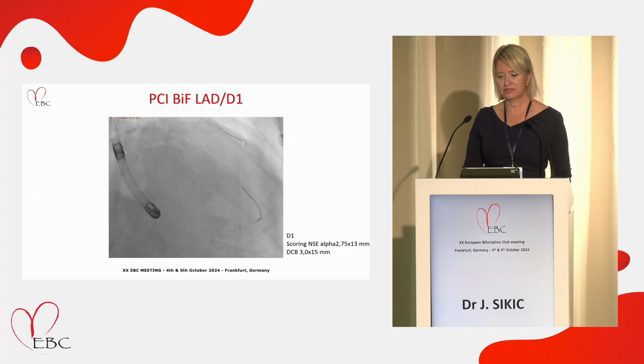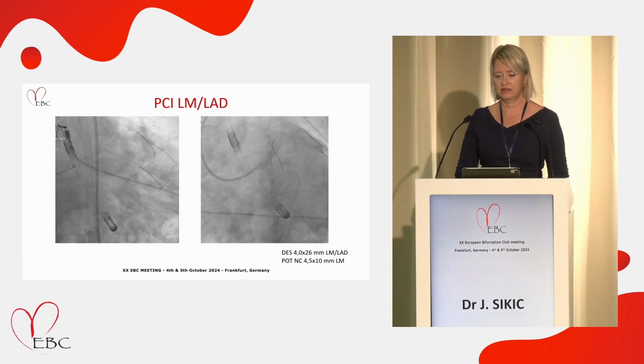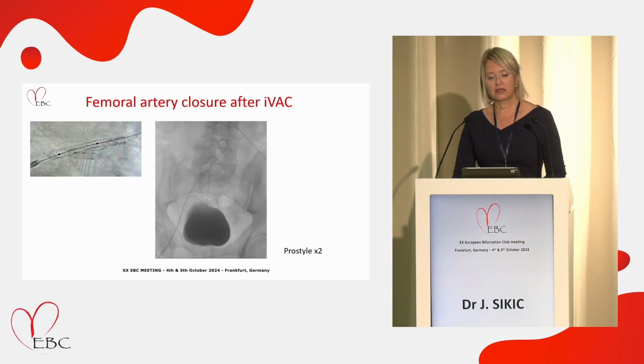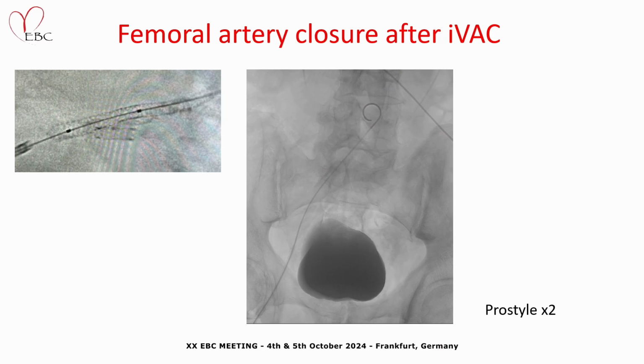Okay, good. This was a rotacut, you saw it. This was a bifurcation. This was a left main and LAD. And, okay. So I just took a StentBoost. And you can see here that there is quite a good position of the stent in left main and LAD. And it's a good expansion.